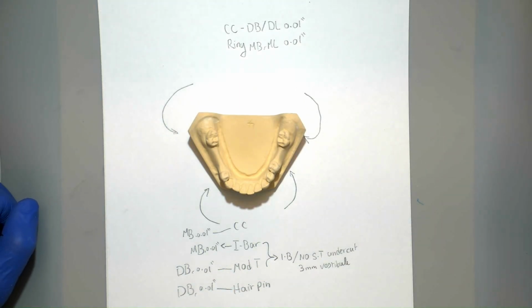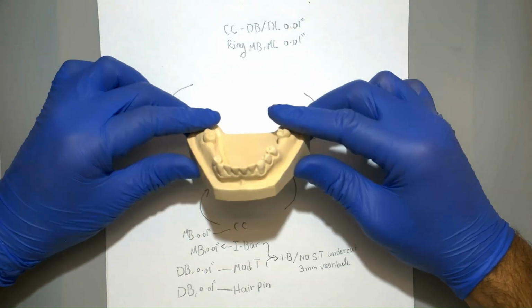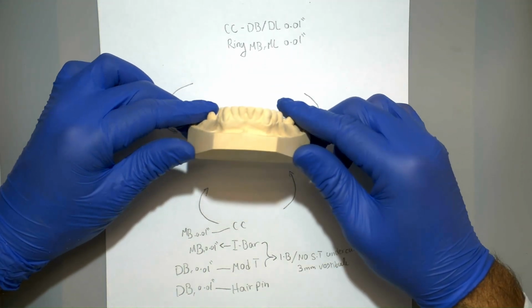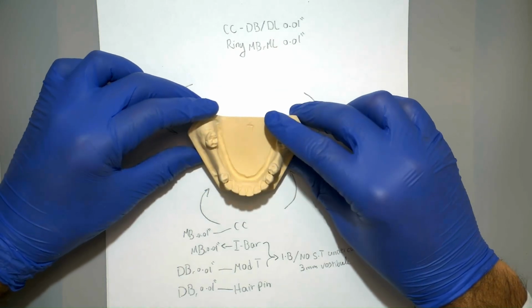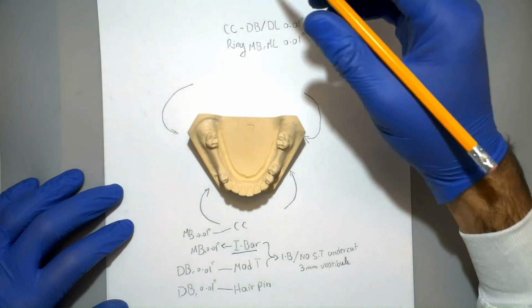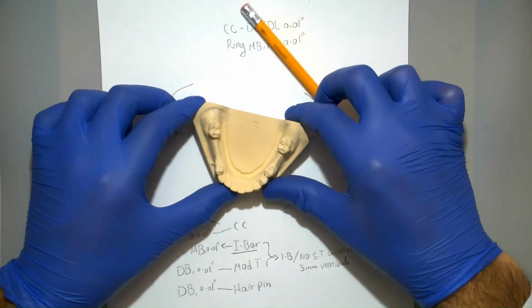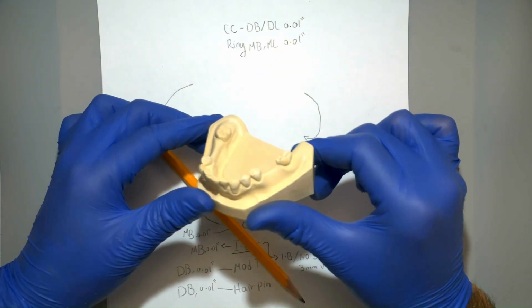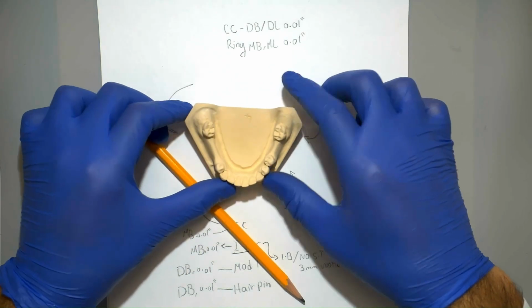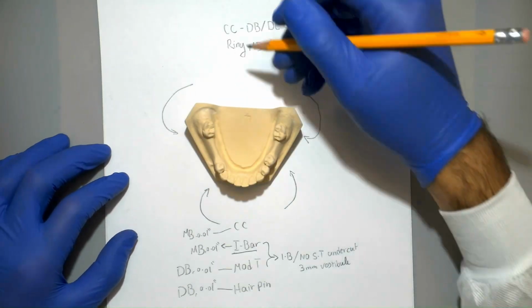For the anterior abutments, there does not seem to be any soft tissue undercuts, and buccal vestibular depth seems to be adequate, so we'll be going for an I-bar, searching for a 0.01 inch undercut on the mid-buccal or the mesiobuccal. For the posterior abutments, there seems to be a lingual inclination suggesting there's probably a 0.01 inch undercut on the distolingual for a CC clasp.